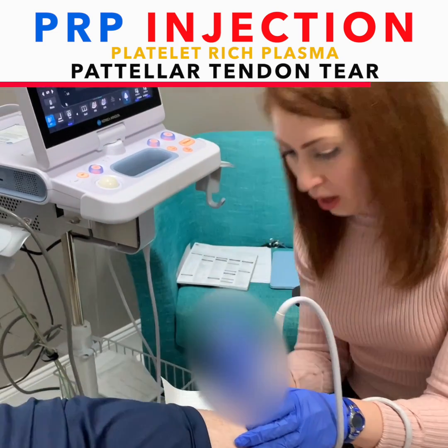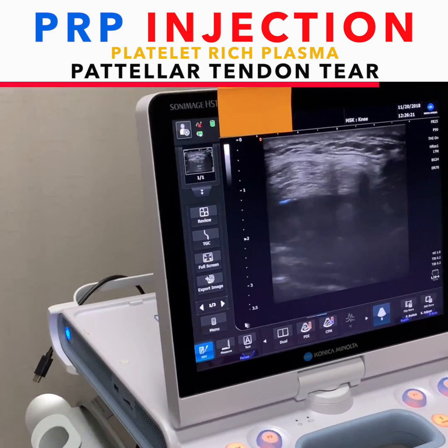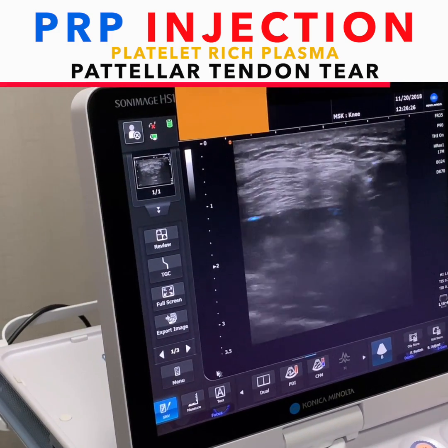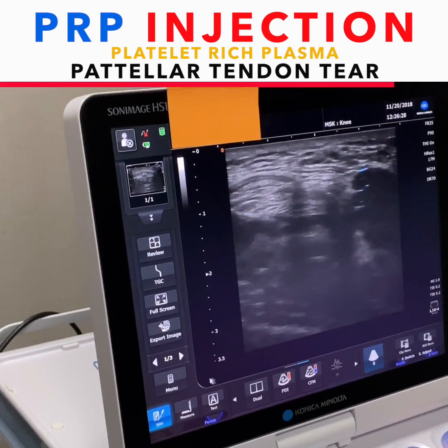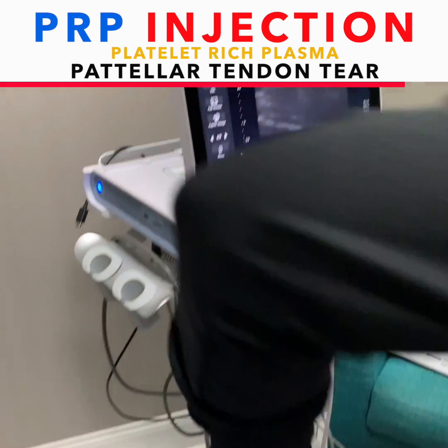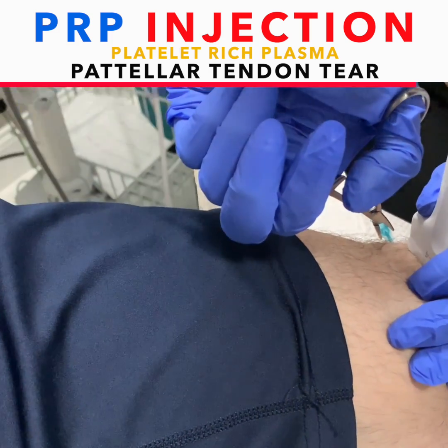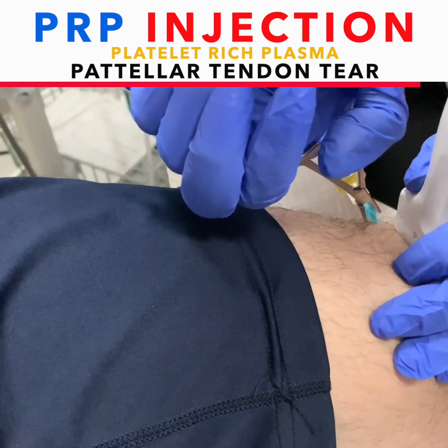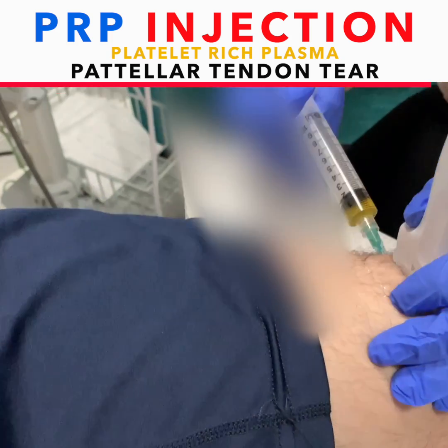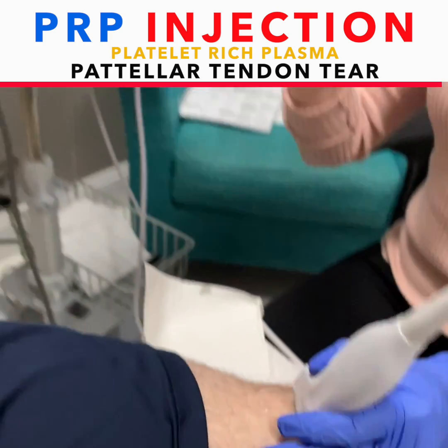This part doesn't — a little pinch — throw it into the joint. Let me have the PRP. That's all.